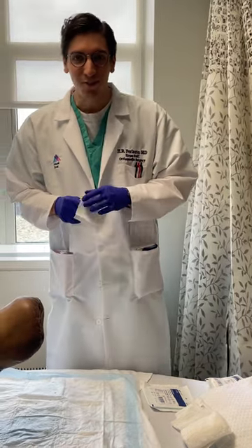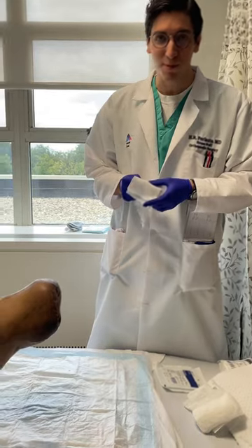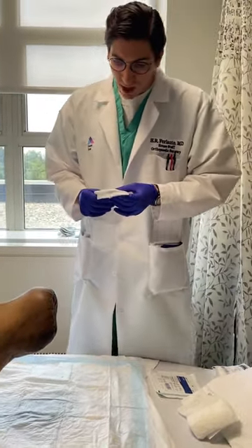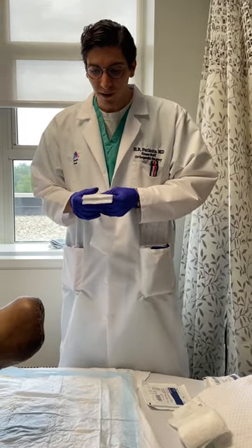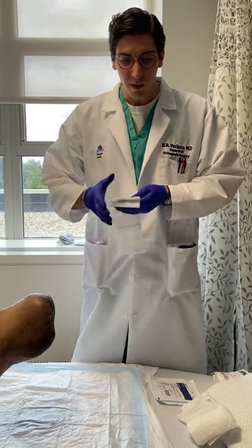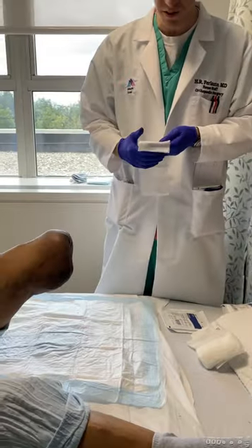Hi, my name is Harrison Furlato, an orthopedic surgery resident. Today we're going to learn how to properly dress a stump. This technique is good for multiple reasons. First of all, it applies good compression and hemostasis to any stump, whether it be a transmetatarsal amputation stump of the foot or below knee amputation stump as we have here.